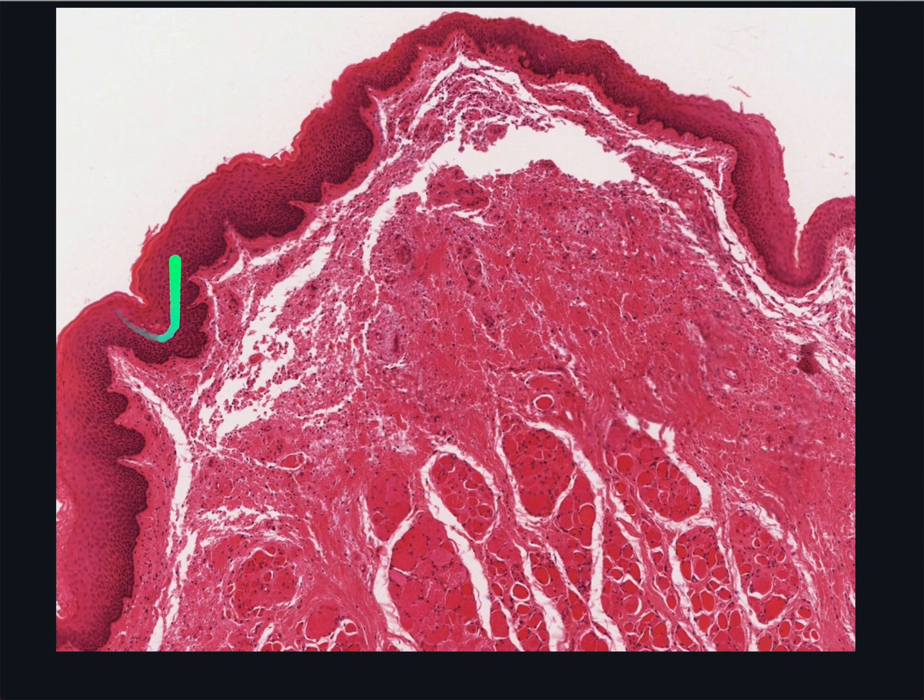Directly over the vocal ligament, the epithelium is stratified squamous epithelium. The transition between the stratified squamous epithelium and the surrounding typical respiratory tract epithelium is relatively sharp and will be further down here out of the plane of this particular section.